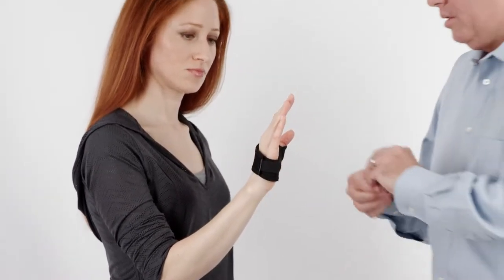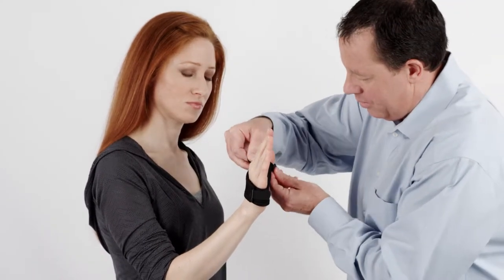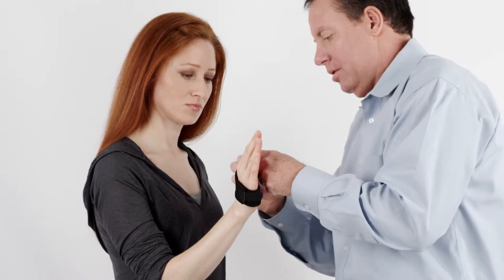Secure hook and loop tabs on the dorsal side of the brace. Secure the accessory strap in the desired position on the thumb.